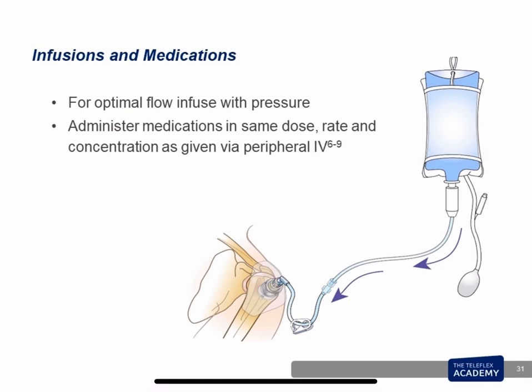There is an inherent pressure in the venous circulation that one needs to overcome, as well as resistance in the bone marrow space. So for the optimal flow rates that we discussed, which is typically about 6.3 liters per hour in the humerus, you need to use a pressure bag or an IV pump of some type of pressure. Flow under gravity won't be as high, especially in the tibia, when one hangs a bag of IV fluids to gravity. So you need to use a pressure bag.